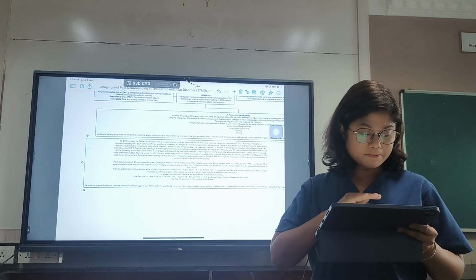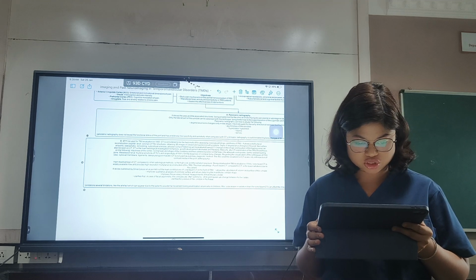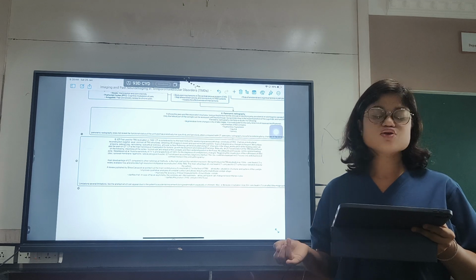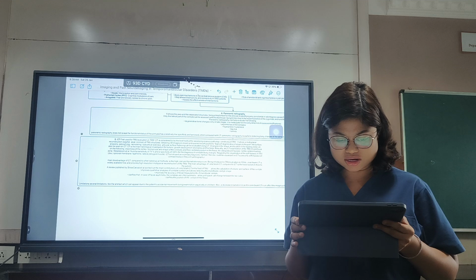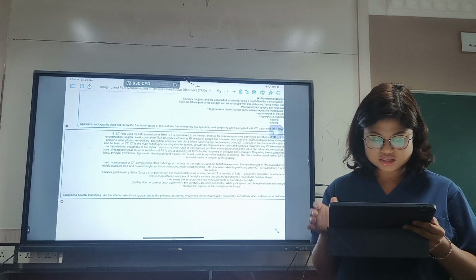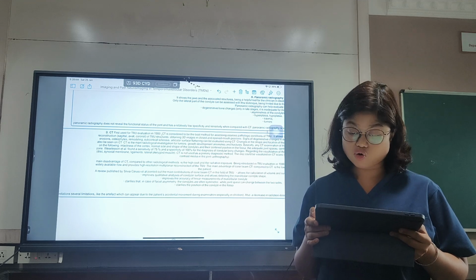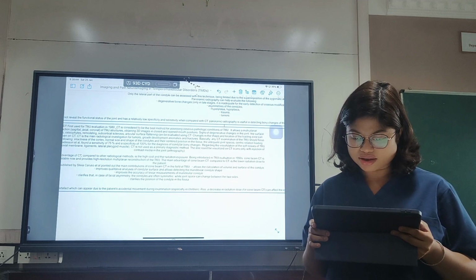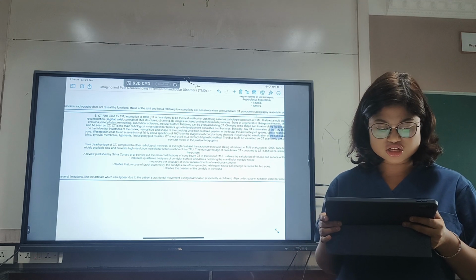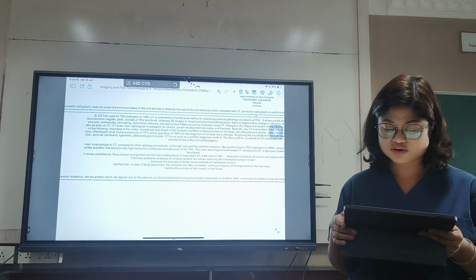It allows a multi-planar approach, which is having the sagittal, coronal and the axial views of the TMJ structures, obtaining 3D images in closed and open mouth positions. Signs of degenerative changes can be seen in the joint, like surface erosions, osteophytes, remodeling, subcortical sclerosis, and articular surface flattening, can also be evaluated using CT. Changes in the shape and the location of the condyle and the loading zone can also be seen.